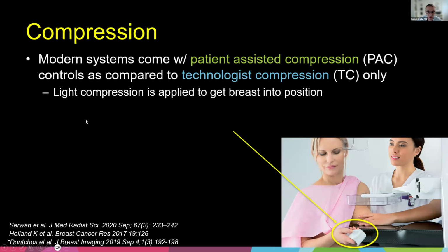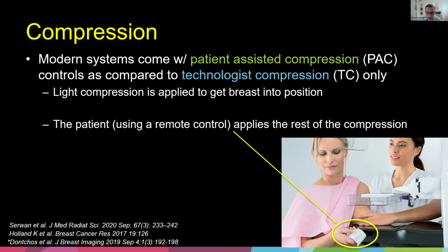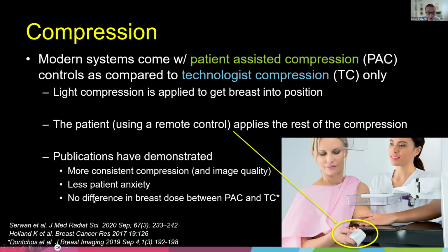So the way this works is the technologist will get the breast into position, and then they will lower the compression paddle until it's lightly compressing the breast. Then the patient has this control here, and the patient themselves will actually apply the remainder of the compression. And they have shown in publications that when the patient is in charge, they see more consistent compression, so better general and consistent image quality, less patient anxiety because they're in control.